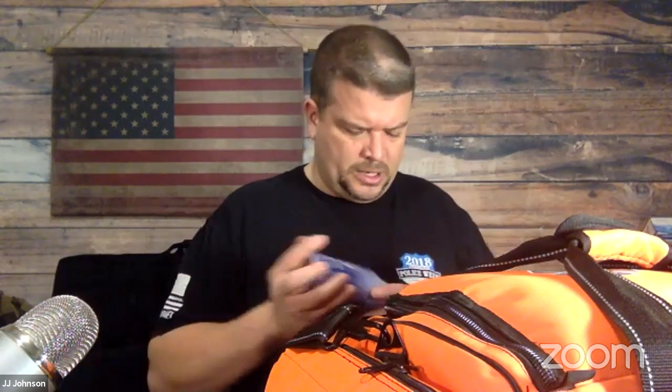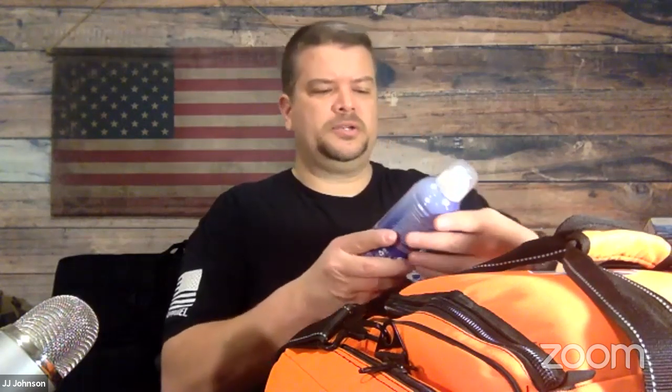So I'll just do this first pocket here on the outside. I try to have somewhat of a rhyme or reason to it, but I admit that it's not entirely organized perfectly. So first thing I got here is some wound wash, and it looks like I'm going to have to replace that. This is just NeilMed wound wash. What I'm going to do with the stuff that hasn't been opened, that's expired, is keep it, because a lot of this stuff's probably still good. I'll put it in a box that says expired and we'll use that as a last resort kind of thing.